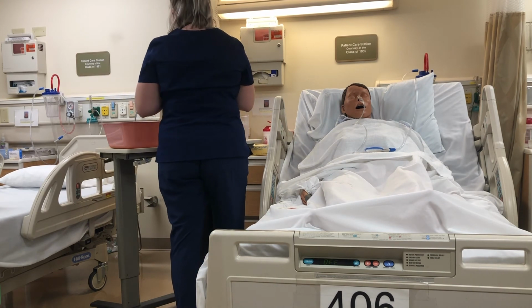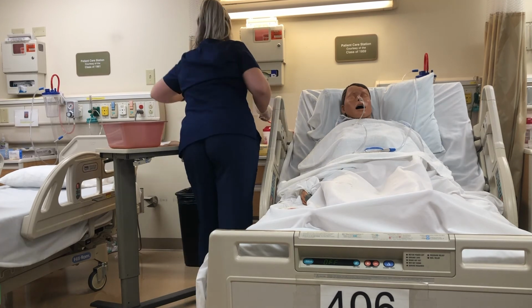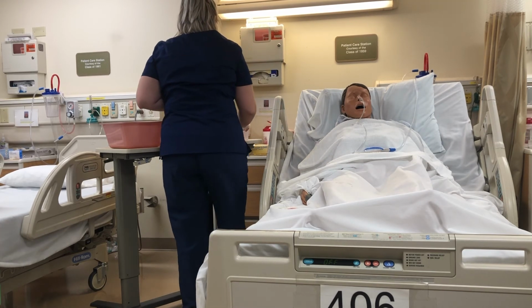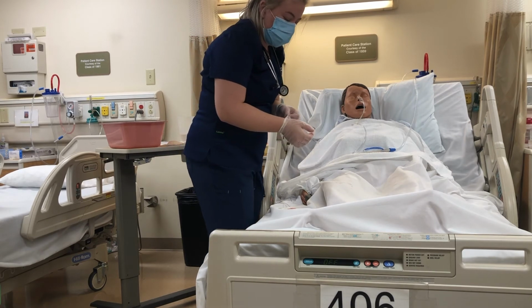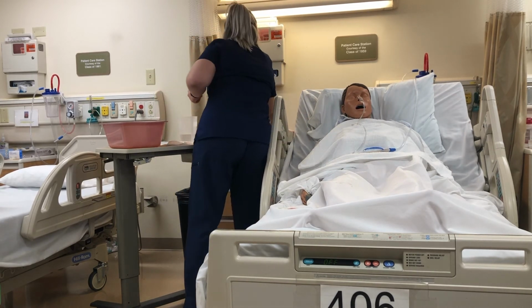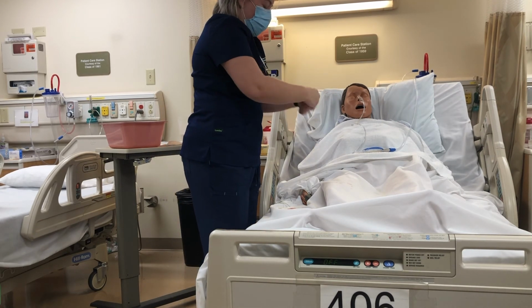I'm going to get my workstation cleaned up here. Do you have any questions? At this point, we're just waiting for x-ray to come in your room, and they're going to do your chest x-ray. That's going to indicate that the tube is in fact in your stomach. So it looks like your oxygen is looking great. I'm just going to wash my hands here. I'm going to take this SpO2 machine off of you, okay?